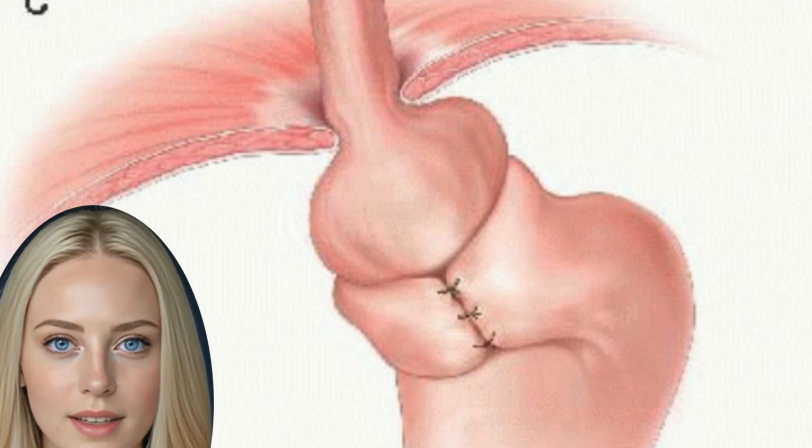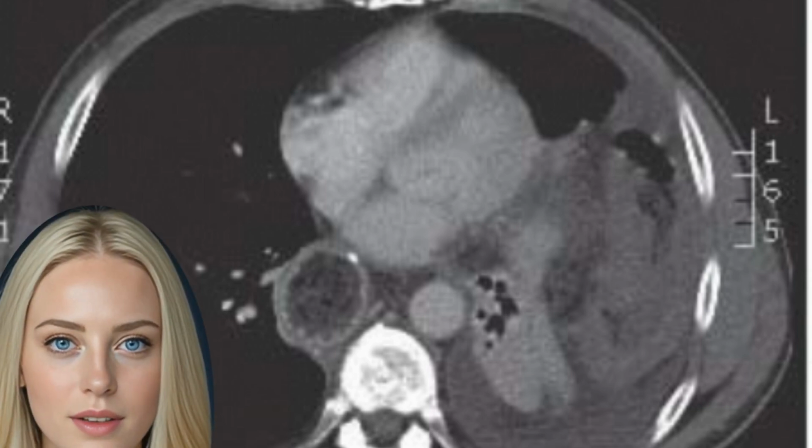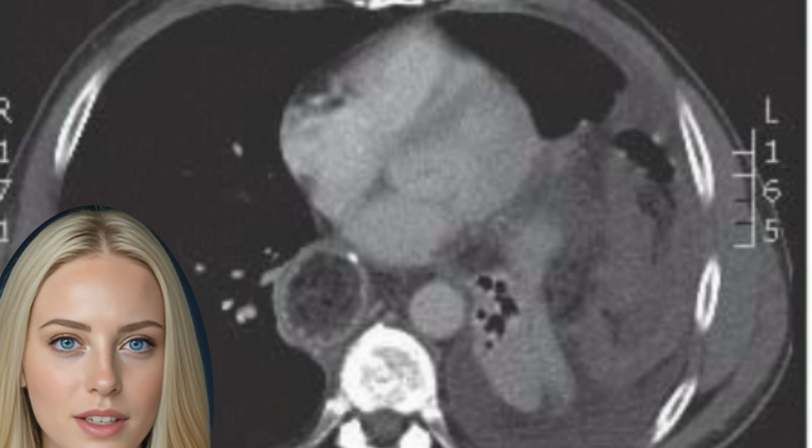Assume extensive mediastinal dissection will be warranted, and therefore, pleural compromise is a frequent occurrence. The sterile skin preparation must be wide enough on either flank in case tube thoracostomies are necessary from resultant pneumothorax.